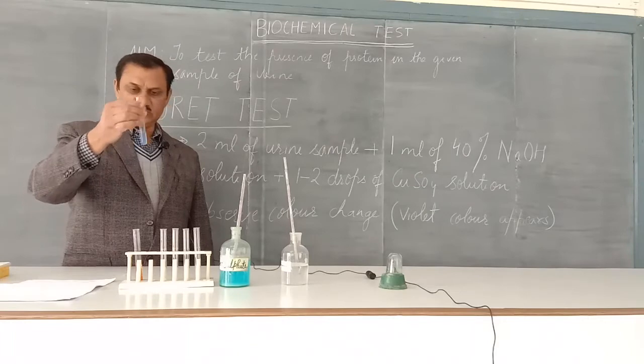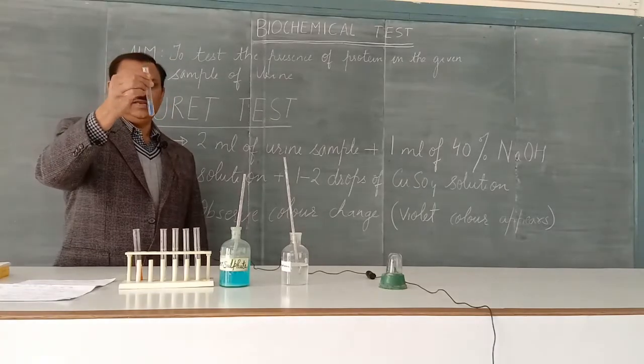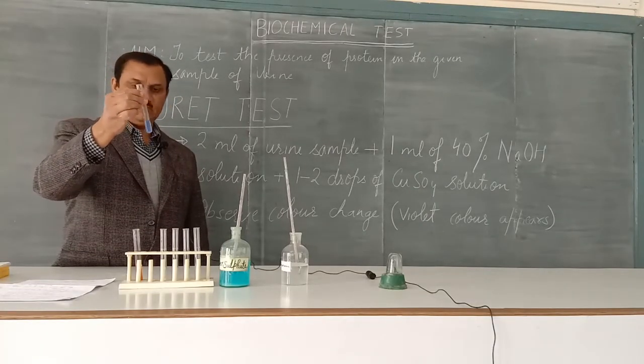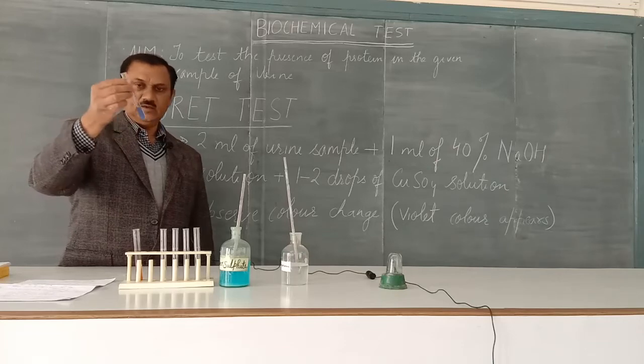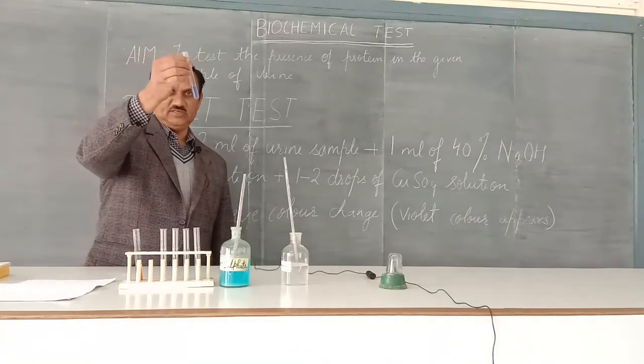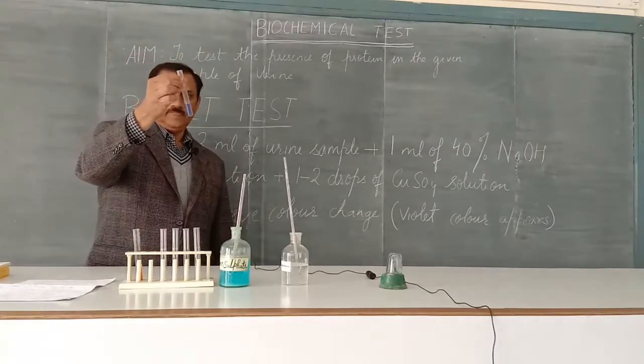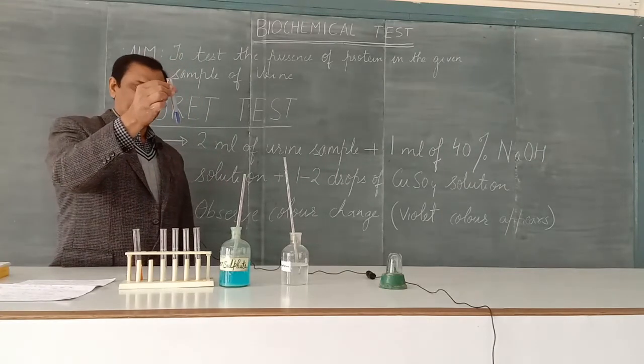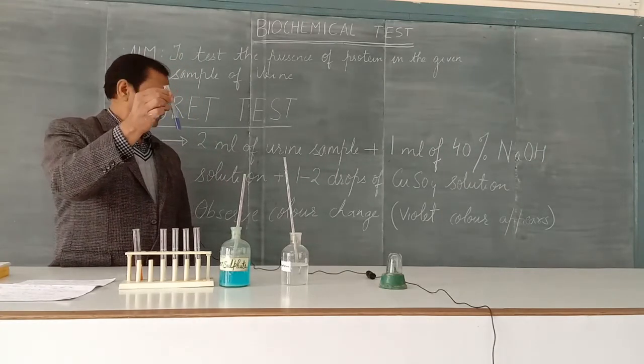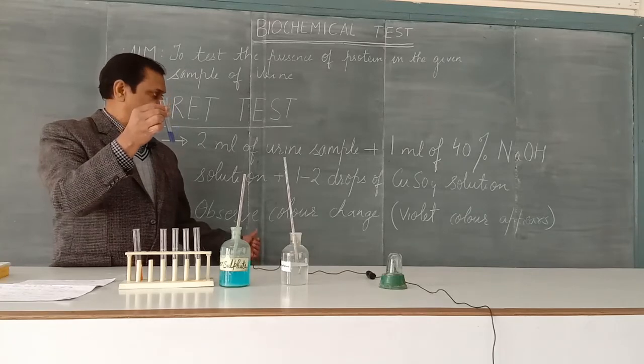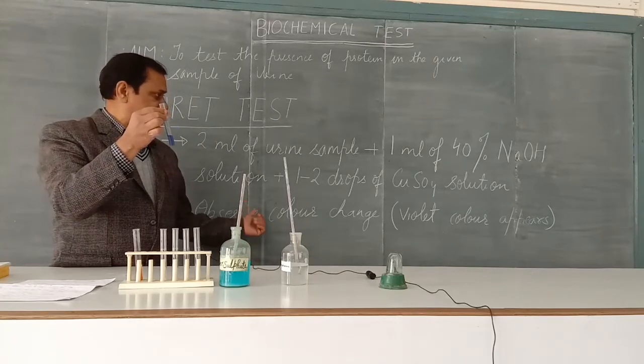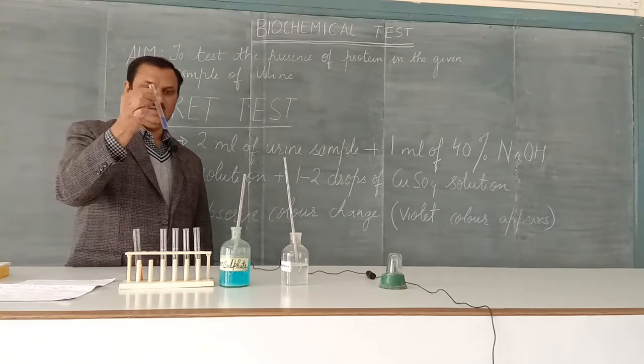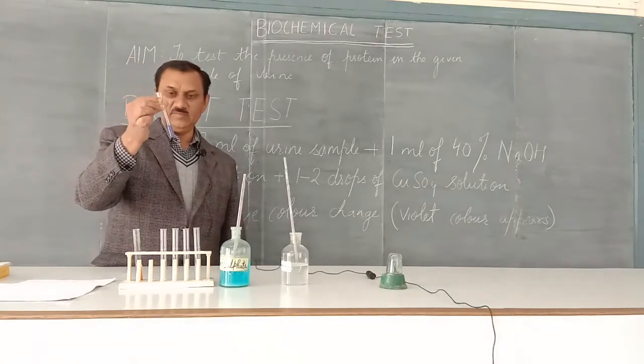There is no need to heat it on the flame. It gives the violet color. Look at the change in color. When the color of the sample changes to violet by adding the sodium hydroxide and the copper sulfate solution, it is the confirmed test.